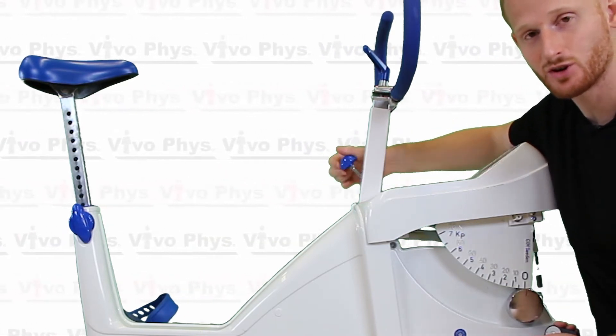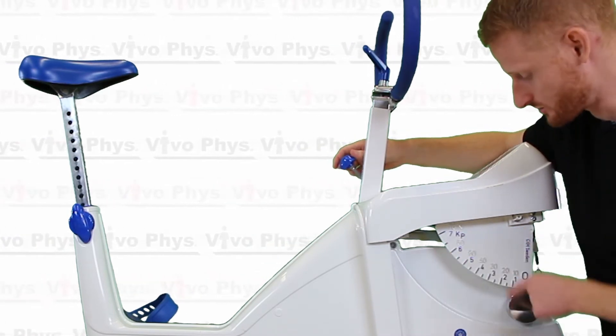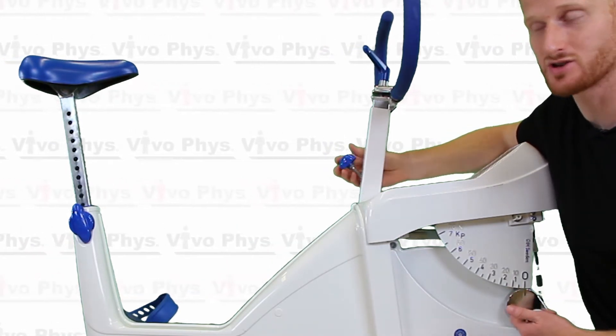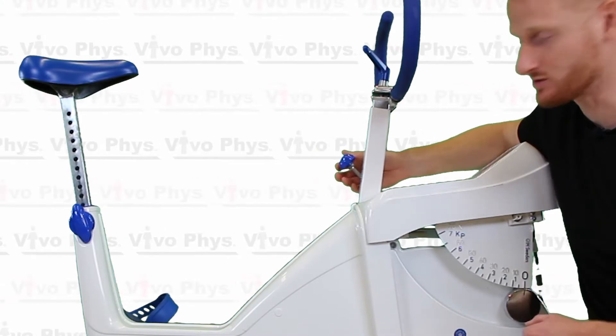You are turning the resistance up by turning the knob when nobody's pedaling, but it doesn't show on the dial. It only shows the resistance when somebody's actually pedaling. So it's best not to adjust the resistance when no one is pedaling because you have no way of knowing where you are within the range of resistance.